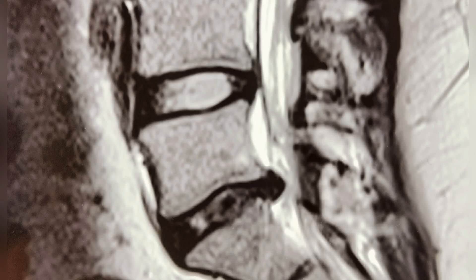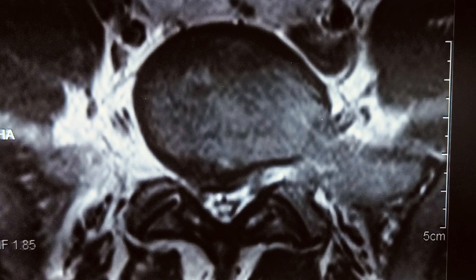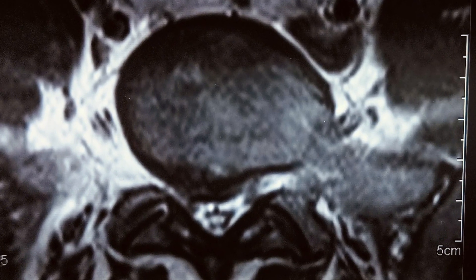Today we are going to do endoscopic disc surgery for this patient at L5-S1. This patient is having right lower leg pain which is because of this disc, which is on the right side.